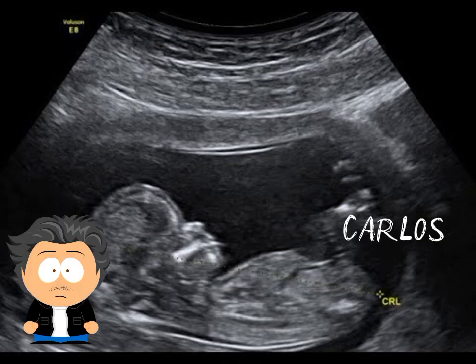Ultrasound is an examination technique that allows images of the interior of the body to be seen using ultrasound. When this ultrasound hits the various tissues of the body, they produce an echo that is translated into images. Its most common use is during pregnancy, although it's also used to examine organs such as the heart, kidneys, and liver, amongst others. What does it involve?